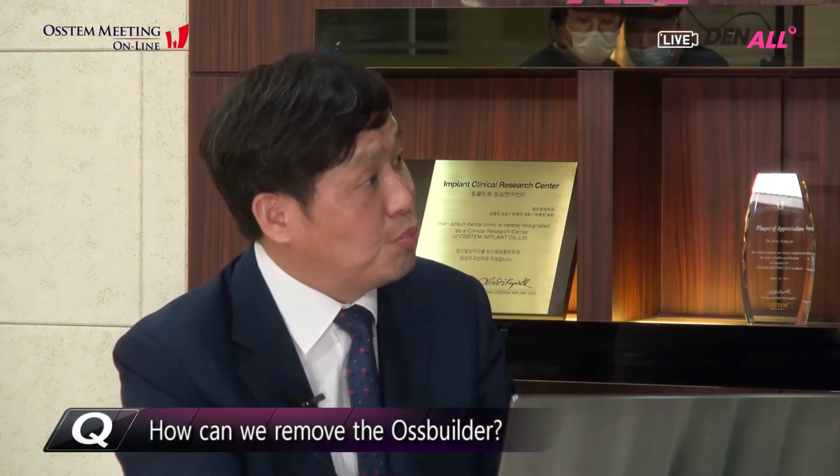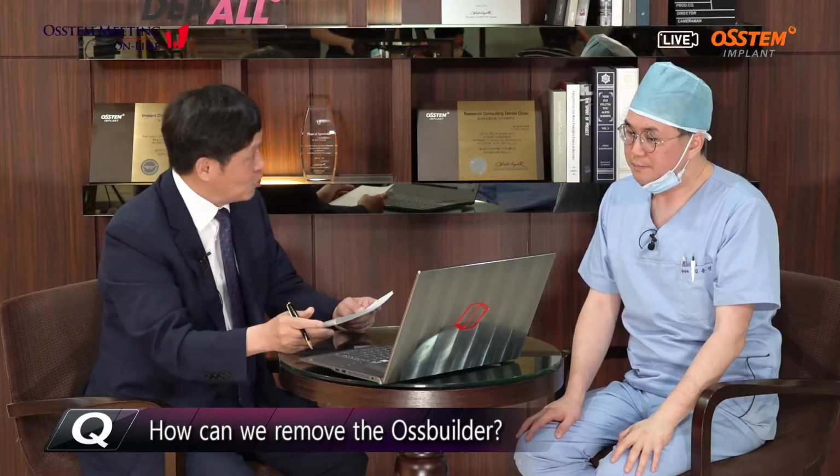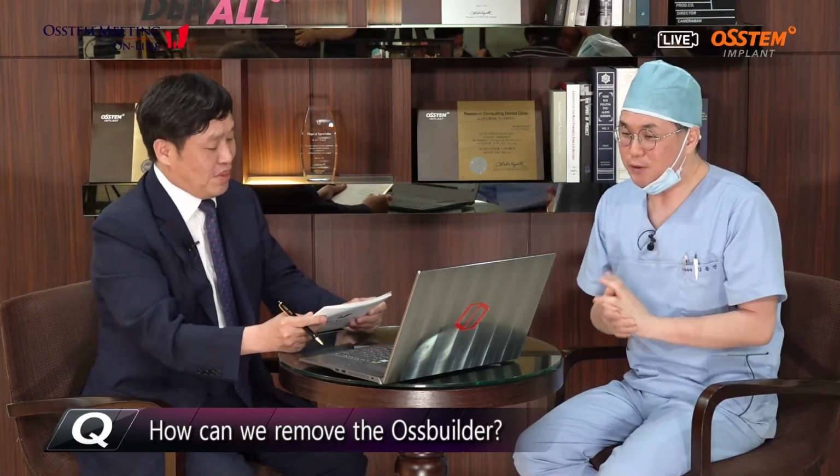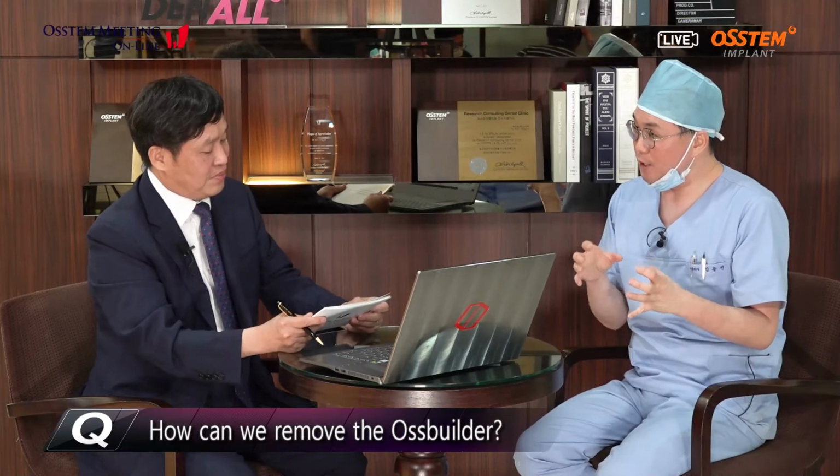And the second question is, how can you remove the Ossbuilder? Some special tip or surgical tip? So as shown during my live surgery, Ossbuilder was connected with the cover cap simply on the top of the implant. So after flap elevation, to remove the Ossbuilder, we just remove the cover cap and then dissect along the outer surface of the Ossbuilder. That's good. Yes.